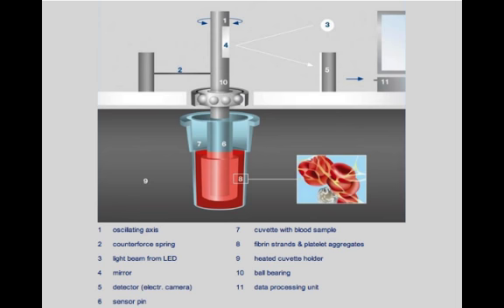So what happens is, once the blood is added into the cuvette, the spindle will oscillate back and forth, and as the clot begins to form, that's what gives you your visual representation on the graph, which we'll see here in a little bit. And my understanding is it withdraws this spindle as it's spinning, and that's what gives us part of our graph. Is that correct? Yes.